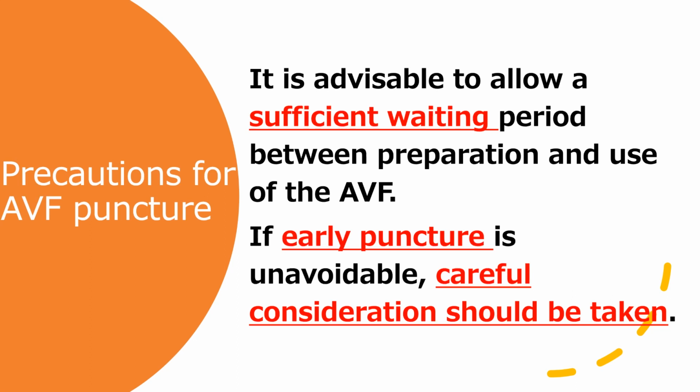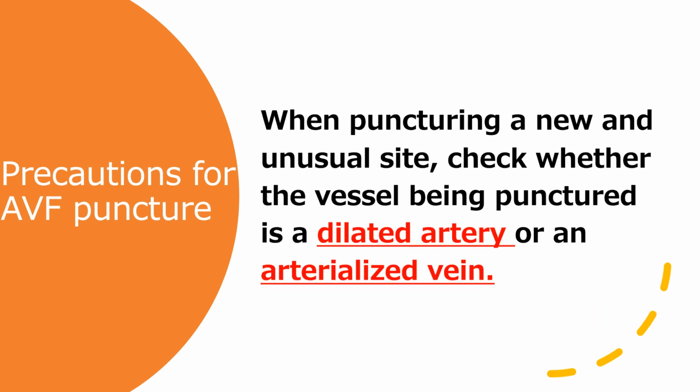As a precaution for AVF puncture, it is advisable to allow a sufficient waiting period between AVF creation and use. If early puncture is unavoidable, sufficient care should be taken. If you are puncturing a new and unusual site, check to see if the vessel you are puncturing is a dilated artery or an arterialized vein.